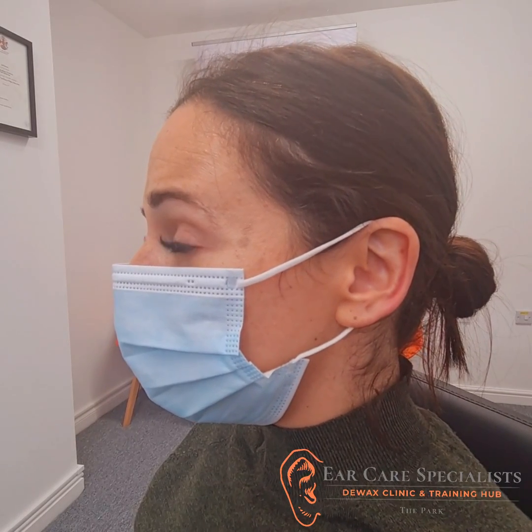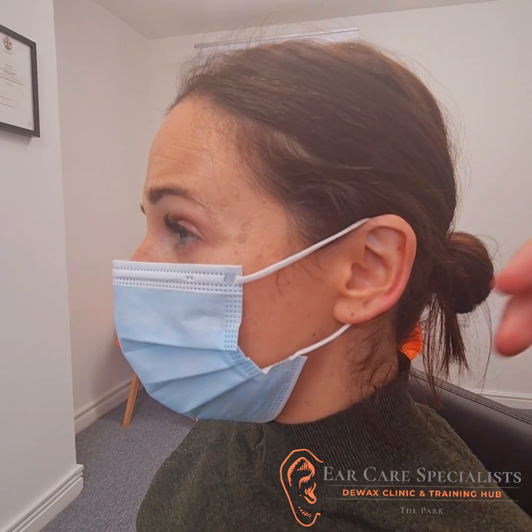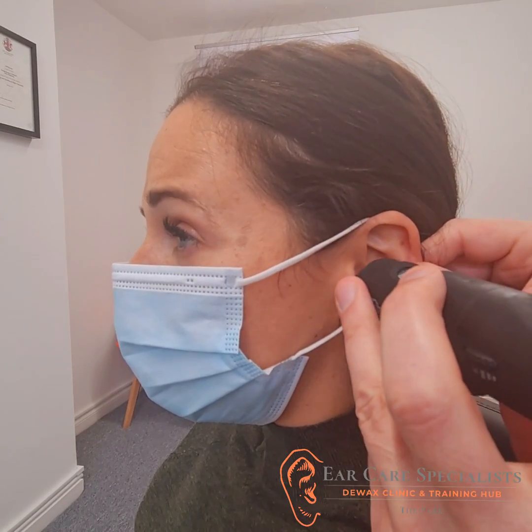We've had a look in the ear and there's wax in there. It's partially occluding. I'm just going to take a picture with my video otoscope as well.